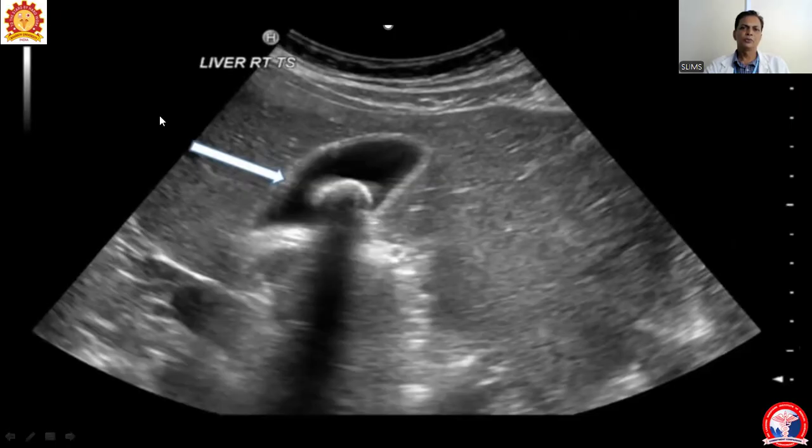We are moving on to gallbladder. This gallbladder has a uniform, relatively thin wall. The wall measures up to 2 mm. Within that, what we are seeing is hypoechoic, uniformly anechoic. Fluid is anechoic on ultrasound. So this is the intraluminal region of the gallbladder.